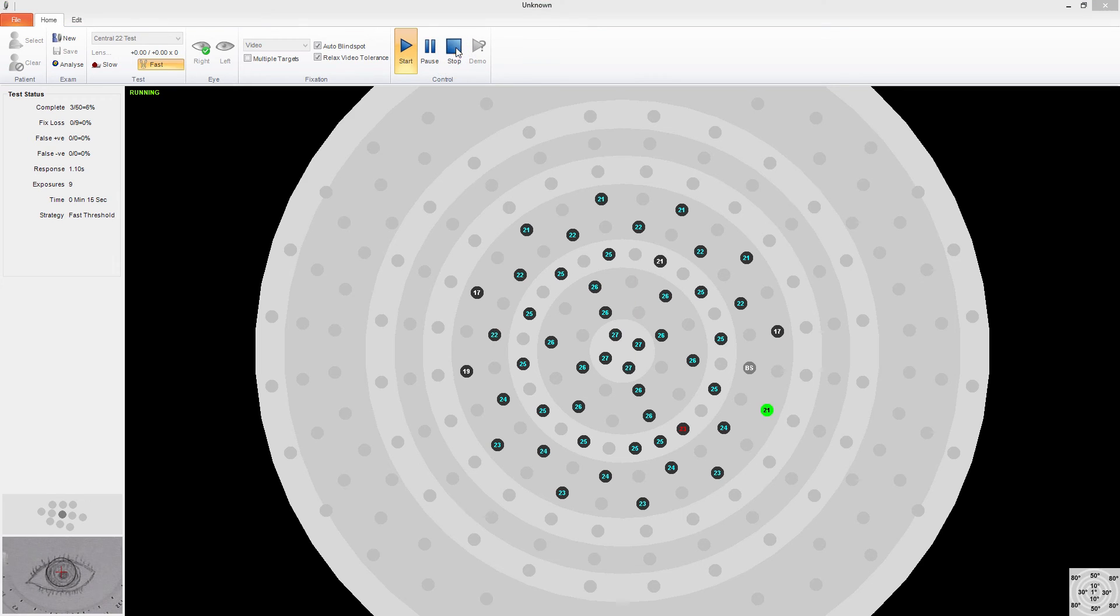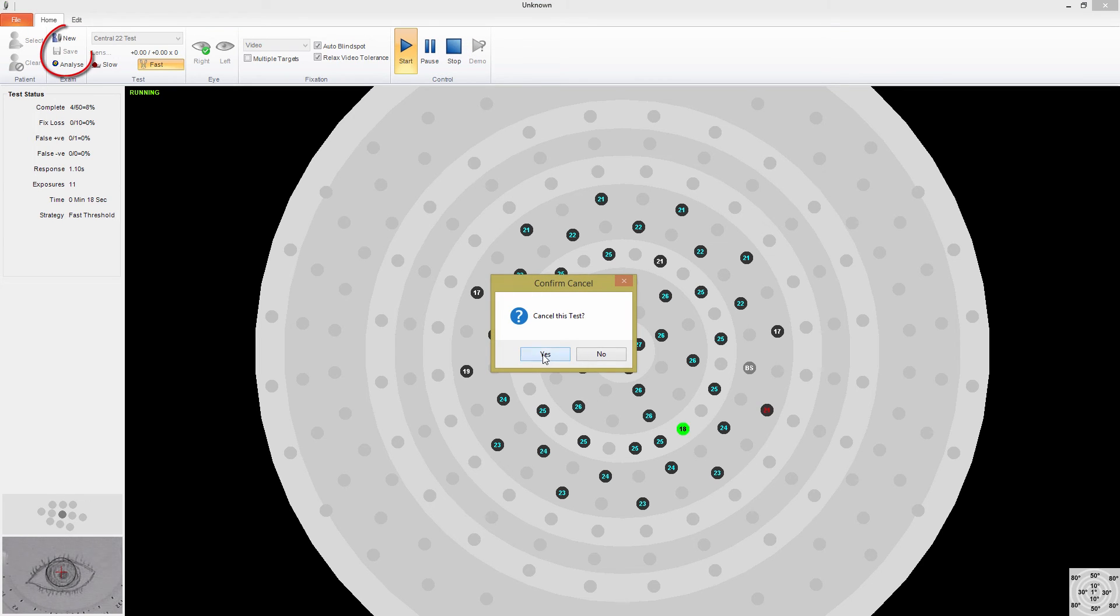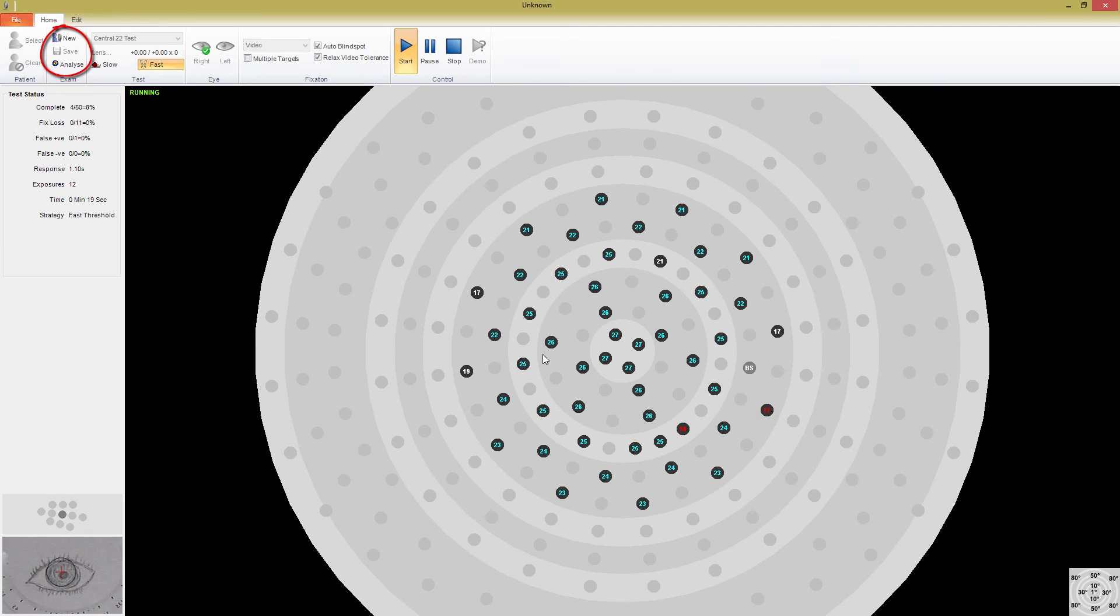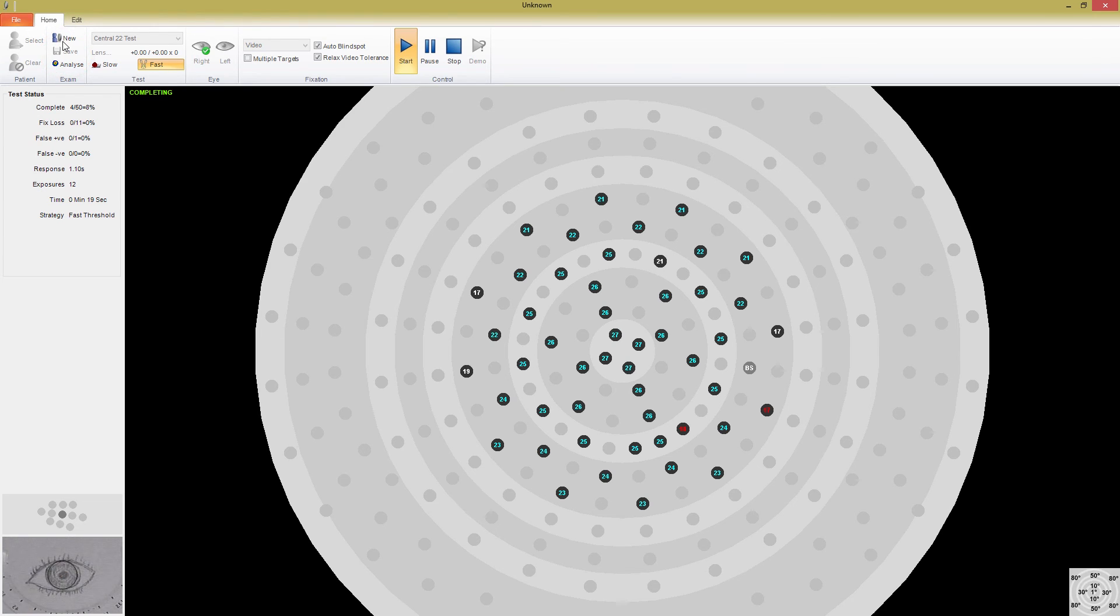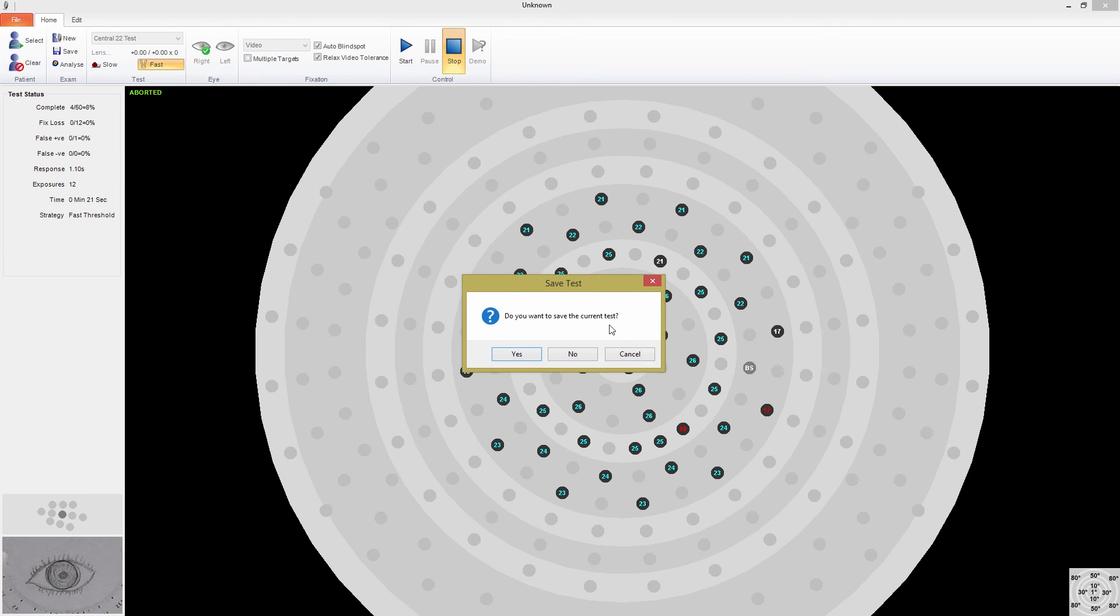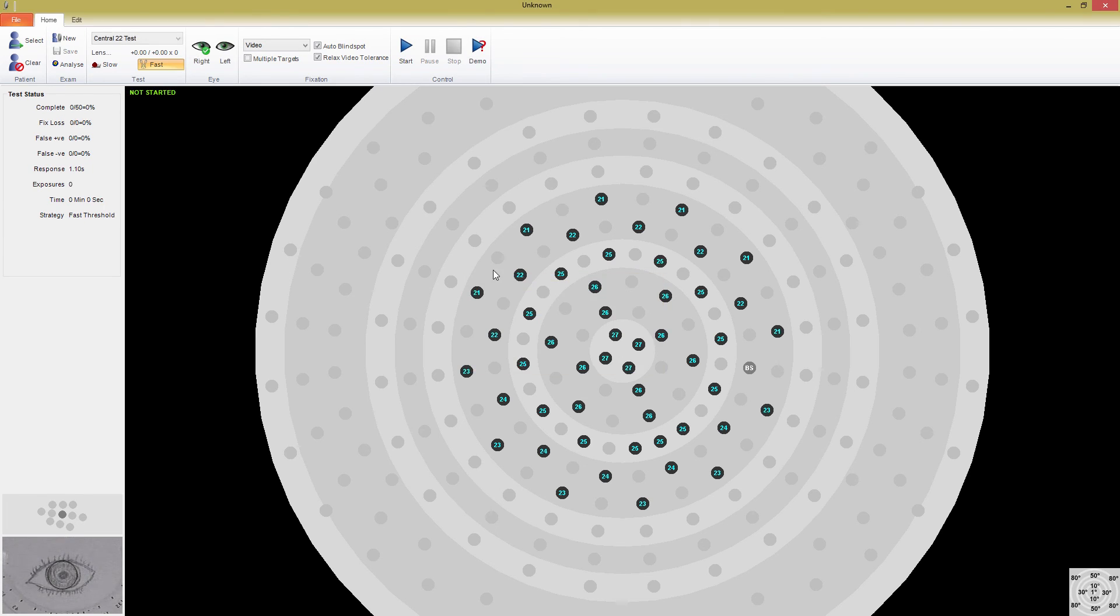Once the test is stopped, you have the option to start a new test, save the test, or analyze it immediately. Since this wasn't a real test, there is very little data to display. Making sure you have enough data is an important point to consider when you decide to stop a test early, and it's not recommended.